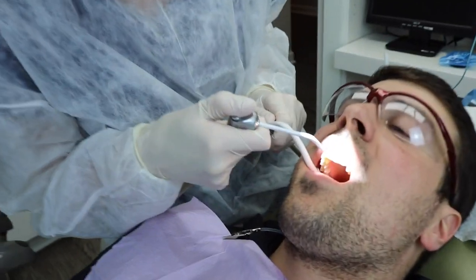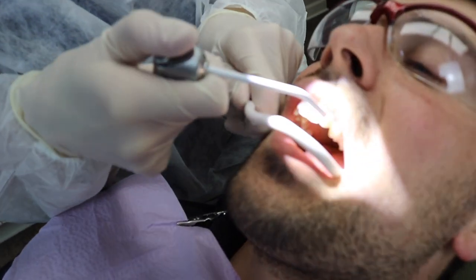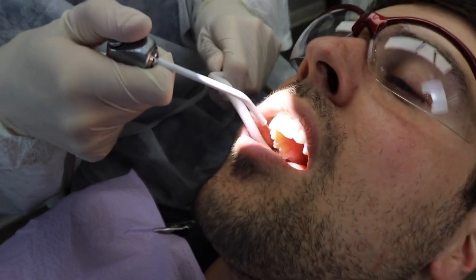Let me give them a little rinse — I'm going to show you one more thing. When I rinse, I always keep the suction in the corner. Go ahead and close.